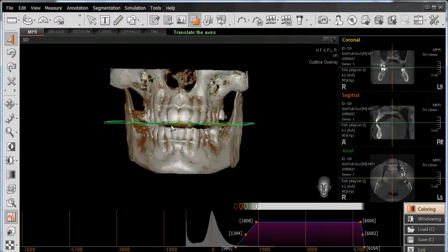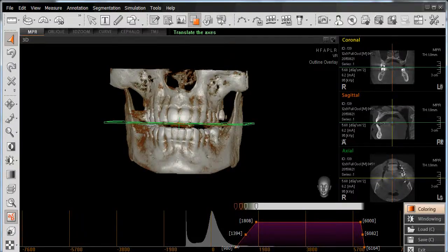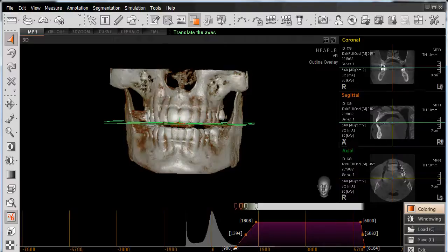From here we move on to establishing our color range. The purpose behind having color applied to our 3D rendering is that we are trying to view a three-dimensional object — the human anatomy — on a two-dimensional surface, which is our computer screen. Adding color helps create a sense of depth. The color is controlled by the angle of this line. The more vertical this line is, the less color we have; the more shallow the angle, the more color we'll have.